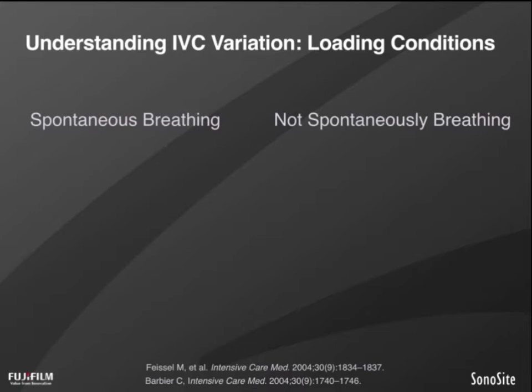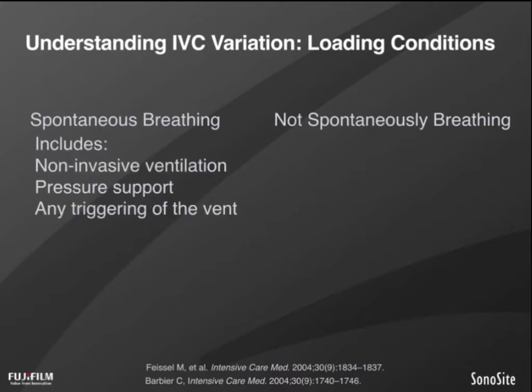Now, those who are not spontaneously breathing, such as those who are on a ventilator, but not just those who are on a ventilator, those who are passive on a ventilator, that is not triggering the ventilator at all, will have the best chances of having standardized, laboratory-quality loading conditions to their IVC. The same breath is prescribed and the same breath is given from breath to breath.